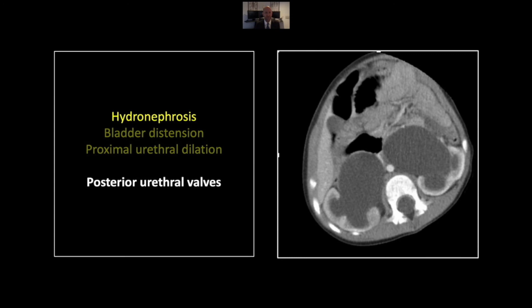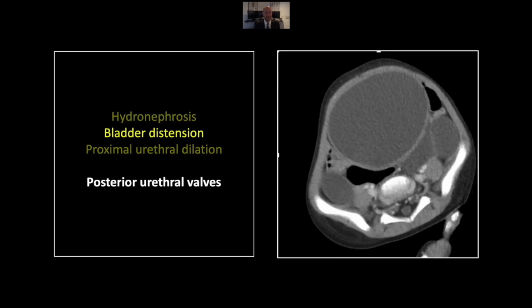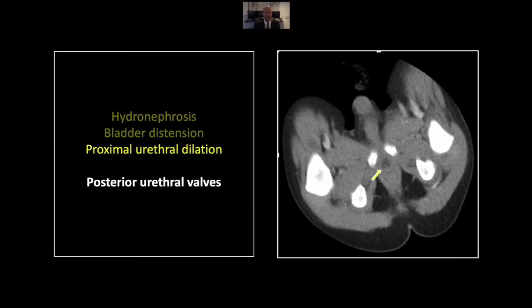Our next case is another chronic obstruction, this time related to posterior urethral valves. We have marked hydronephrosis and some cortical thinning as well, pronounced dilation of both ureters throughout the abdomen, and marked bladder distension. That bladder distension obviously gives you a clue to the fact that there is outlet obstruction here. The critical image is this next one, where you can see the proximal urethra is dilated — just upstream of the posterior urethral valves, which are causing the dynamic obstruction on urination in this patient.